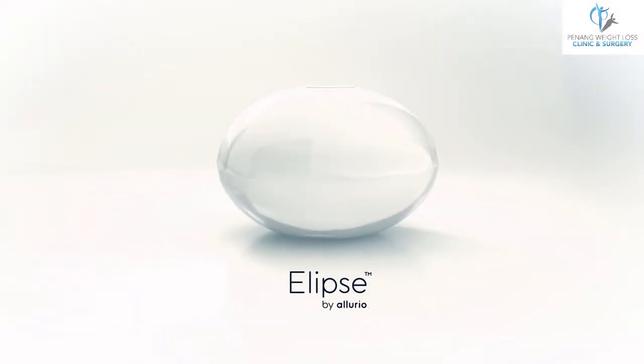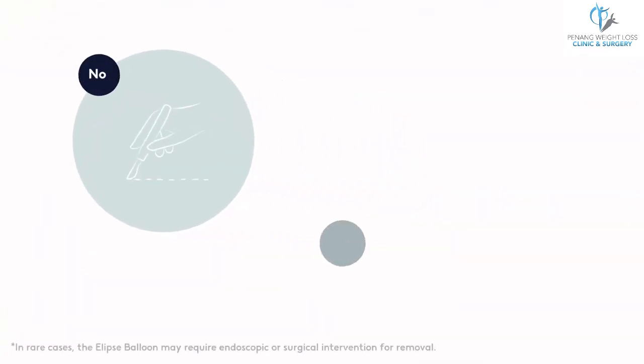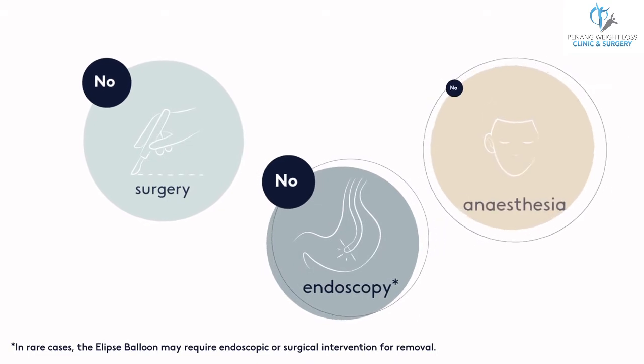Kickstart your weight loss journey with Ellipse — the only gastric balloon with no surgery, endoscopy or anaesthesia.